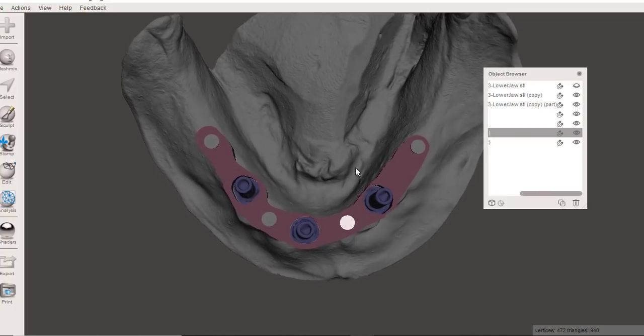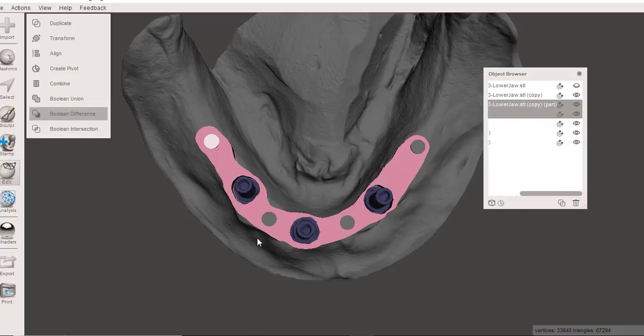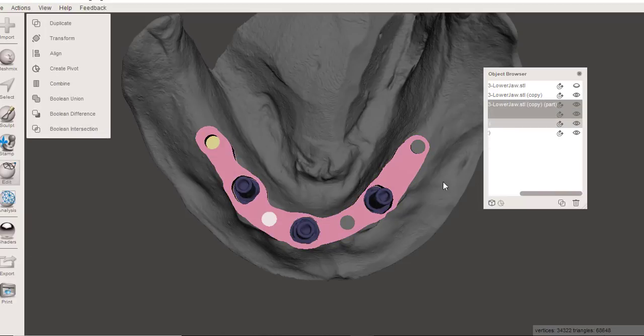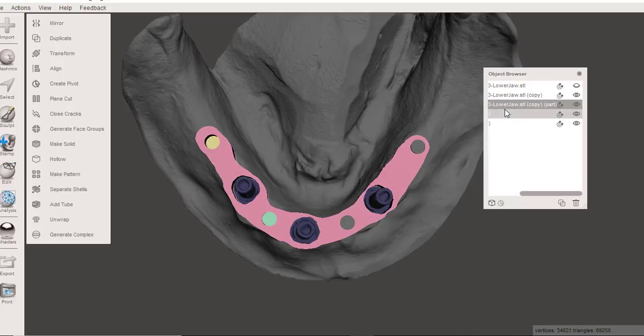All right. And so I've got this surface. I need to first select the bar, and then hold Control and select one of those and hit Boolean difference. We can uncheck auto reduce result and then accept it, and then repeat. Control select, Boolean difference, uncheck auto reduce result, and accept it. I'm going to repeat.